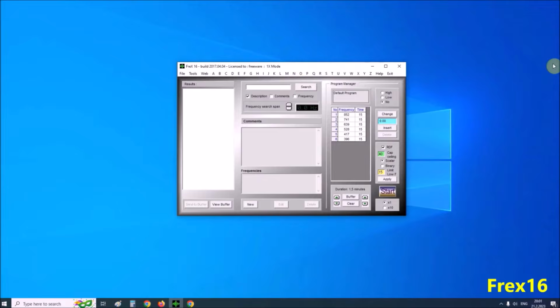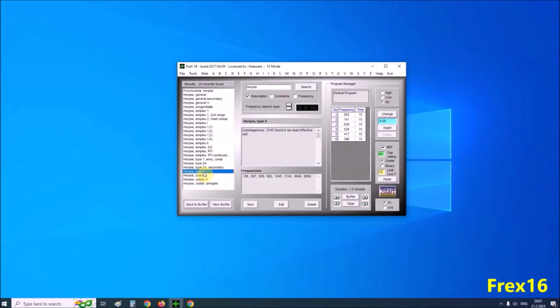So this is the start screen. The application contains a large database with ready-made Rife frequency sequences for various diseases. We can search for the disease according to the initial letter or the search tab. For example, let's look for Rife frequencies for the treatment of herpes simplex type 5. We need to type herpes in this. So this is herpes simplex type 5. These are the given frequencies.